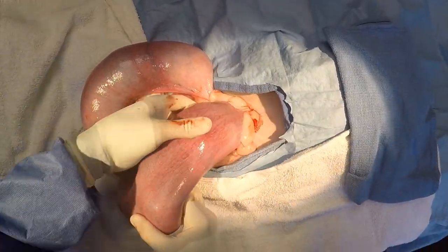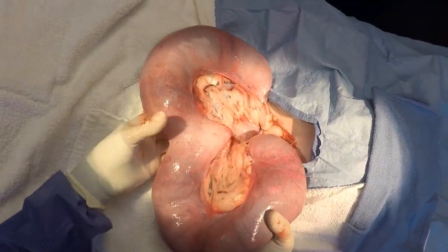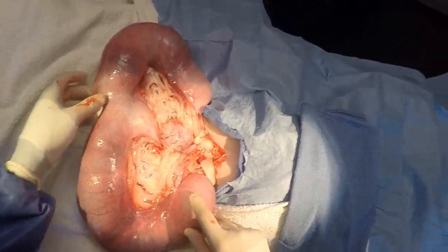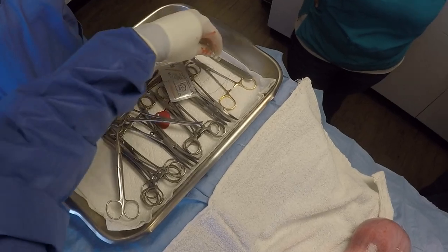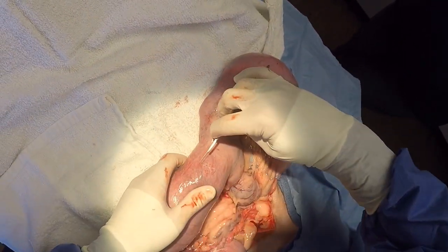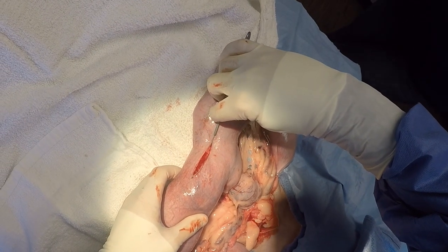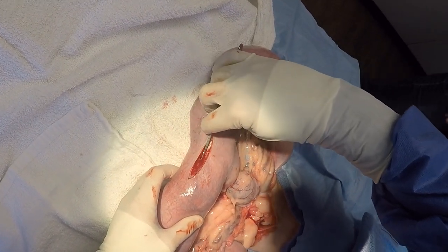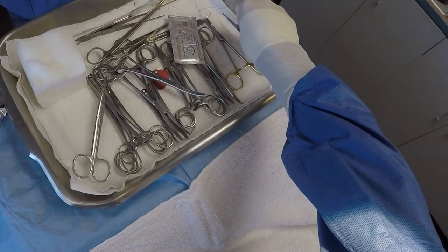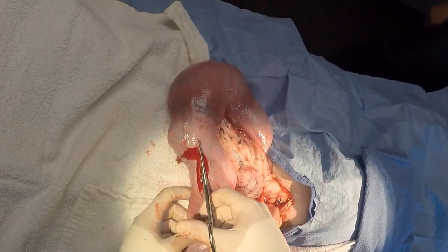Can you see how many puppies may be in this litter, based off of what you're seeing on the uterus itself? Once the uterus is exteriorized, a scalpel blade is once again used to make an incision in the body of the uterus, which is then continued with a pair of scissors.